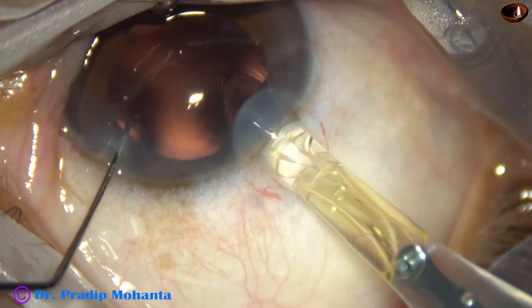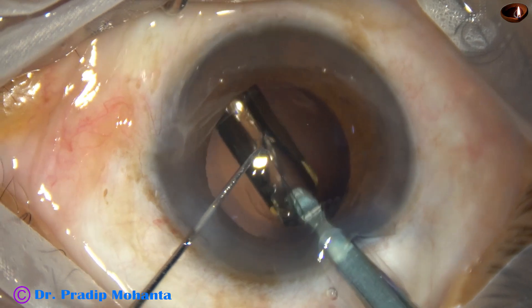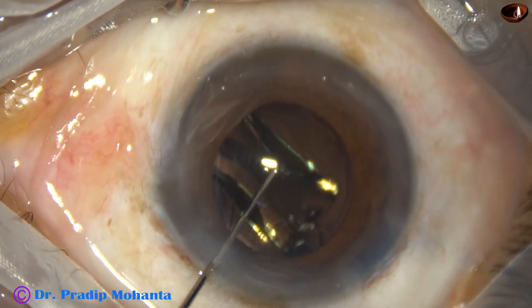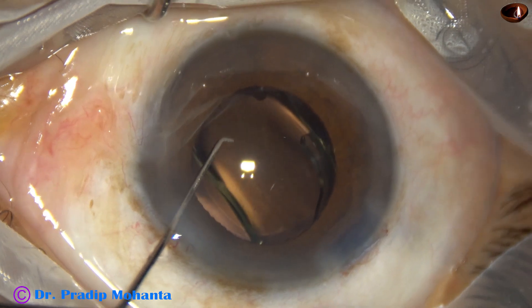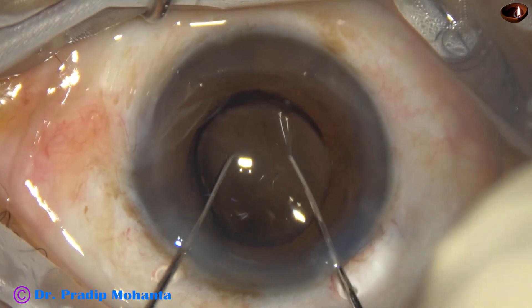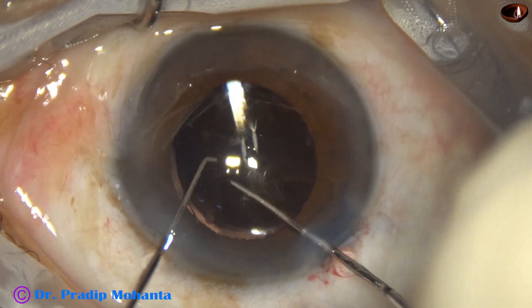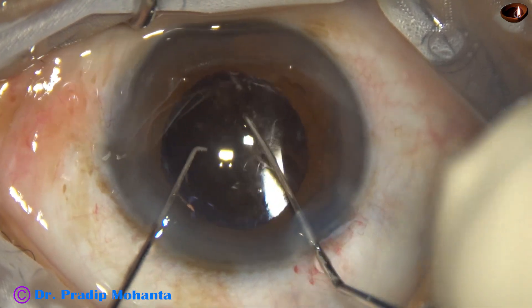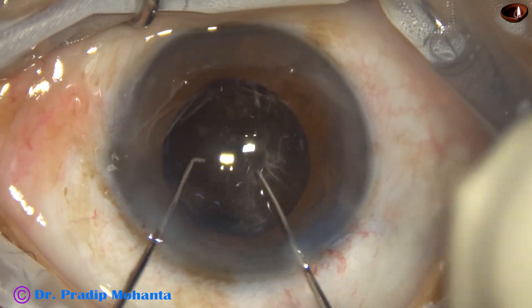Here goes the lens. This is a hydrophobic acrylic, single-piece, aspheric, monofocal intraocular lens. The lens goes into the capsular bag and the haptics take shelter at the equator of the capsular bag. I am dialing the lens so that the haptics are about 90 degrees away from the main incision, so that I can go behind the lens and clean viscoelastic from behind the lens easily.